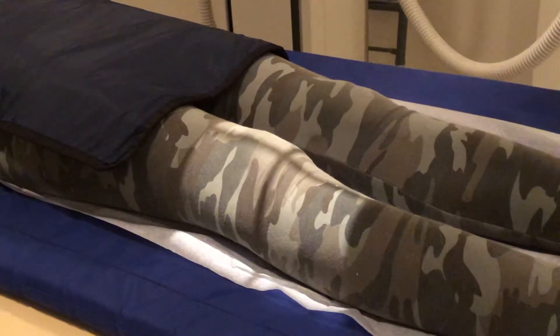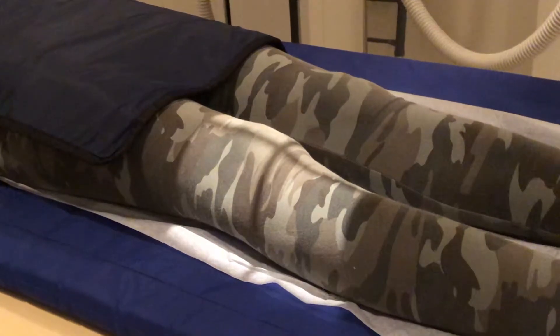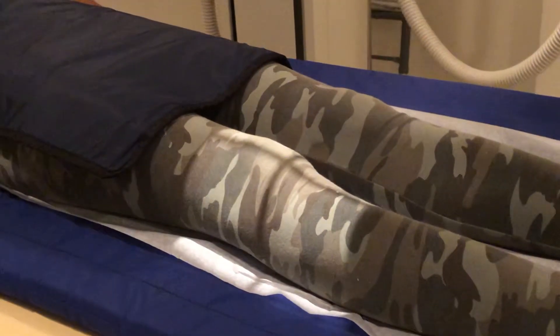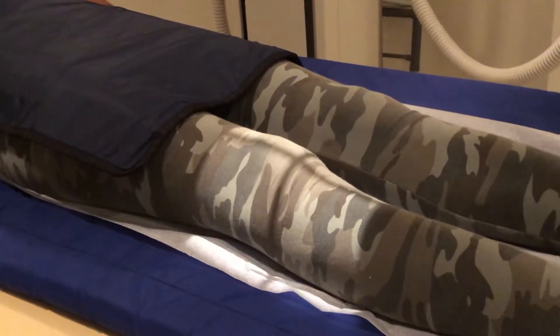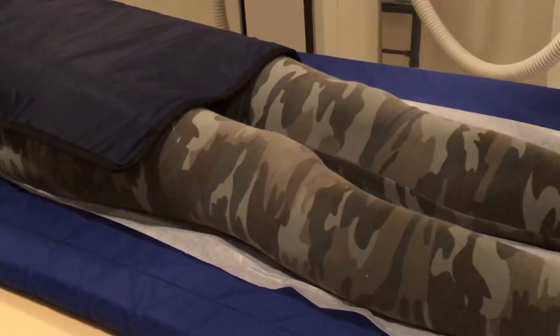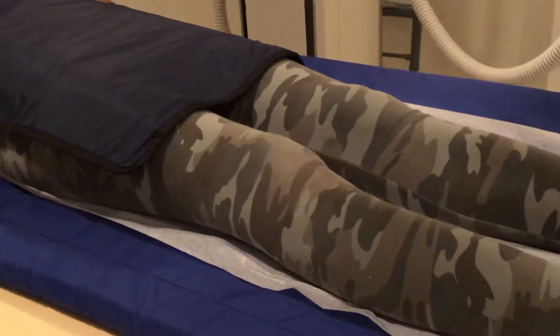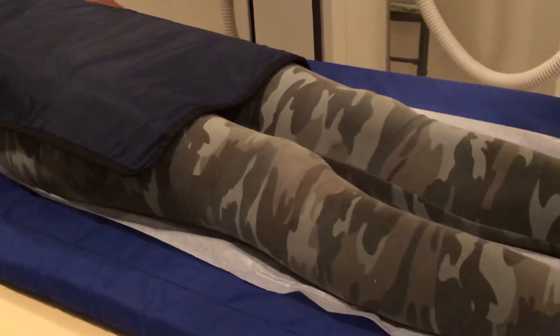You clicked on this video because you want to know how to take an x-ray of the knee and I'm going to show you how to do it perfectly every time. This is a knee x-ray and there are five different views, but I'm going to show you two of them and in another video I'll get to the additional views. The two views on a typical knee x-ray are an AP and a lateral.